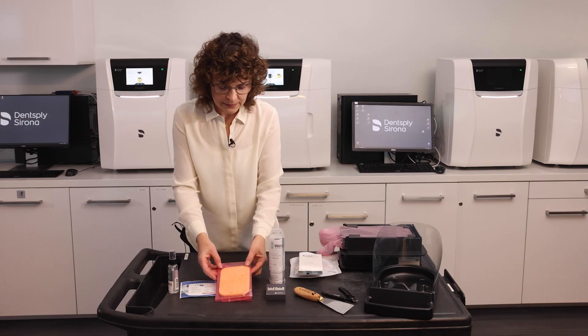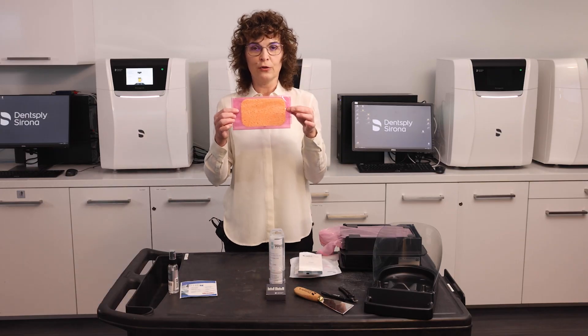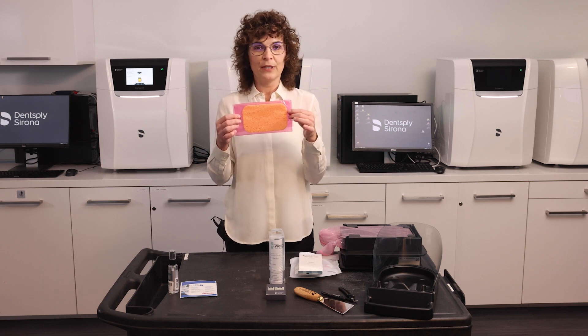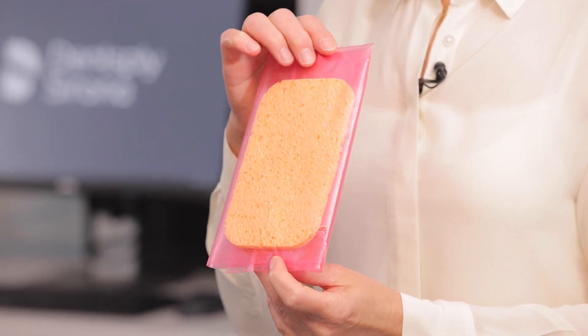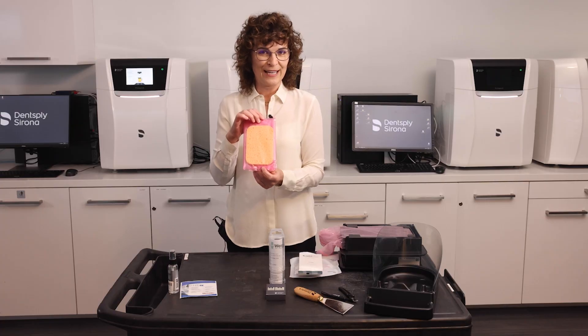The next part is a sponge that goes inside your yellow Prime Print box. That sponge gets soiled with dripping resin. When you determine that it needs to be changed, you will change it according to one of our videos that we have available as well.